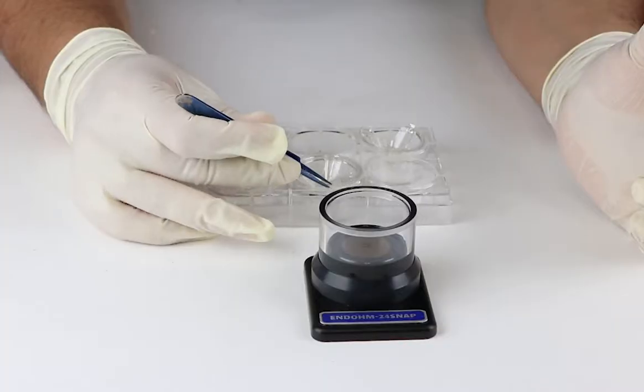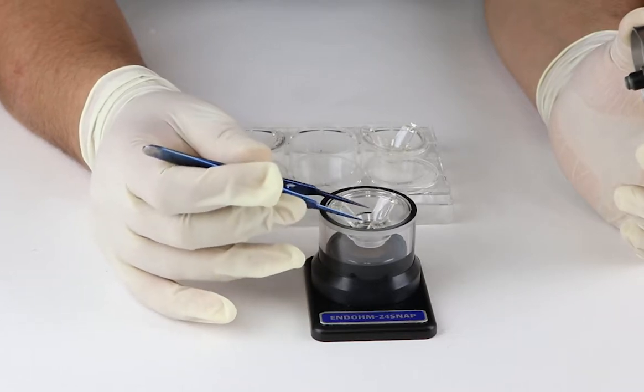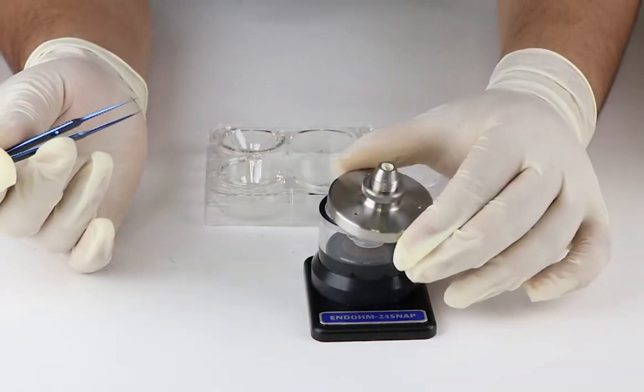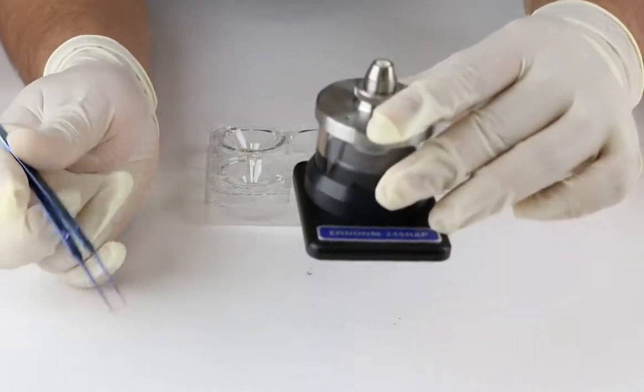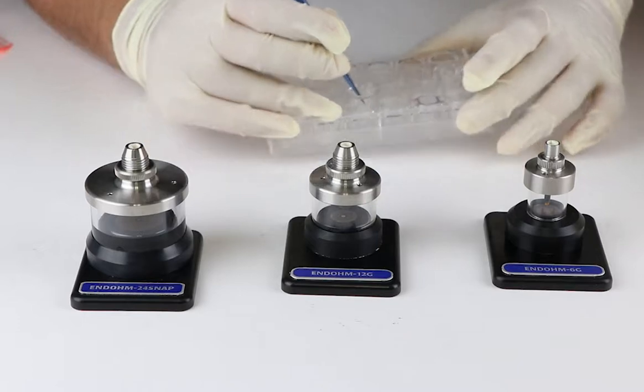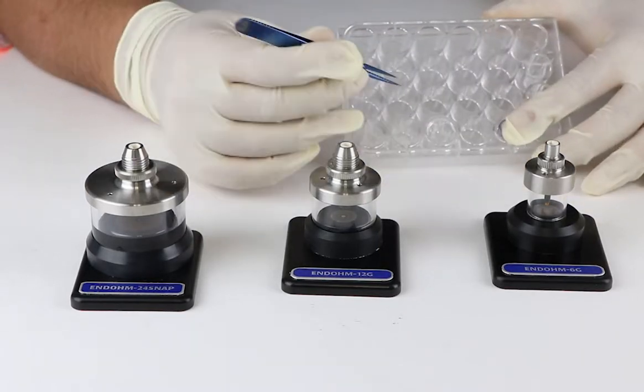The endohm chambers have specific chamber dimensions. For example, a 6-well hanging insert can stay hung inside an endohm 24 snap, and a 12-well hanging insert can hang inside an endohm 12G.